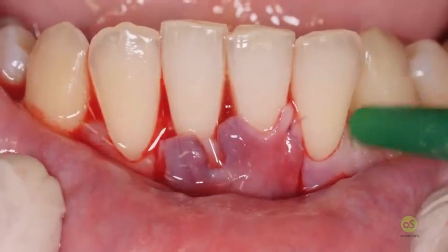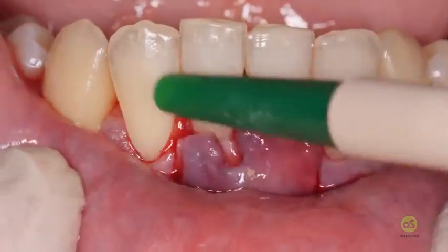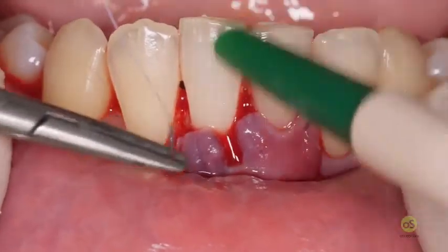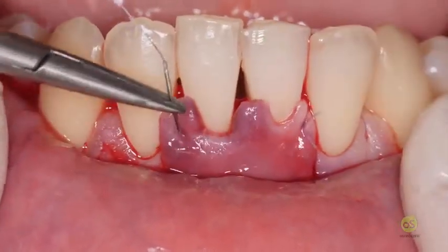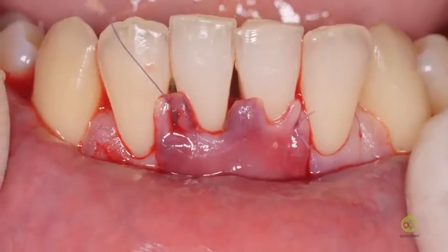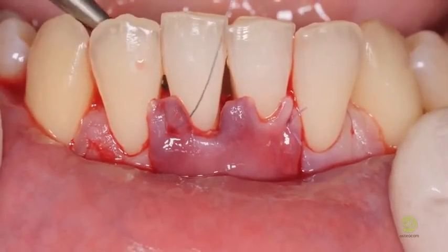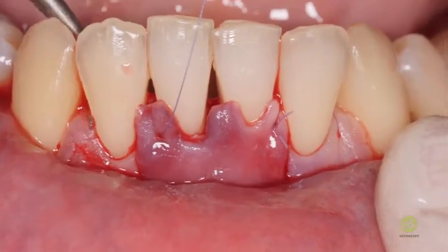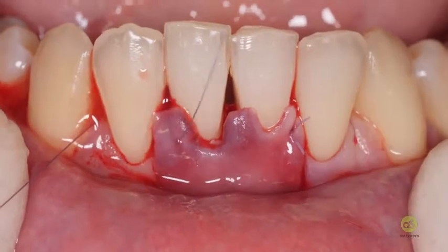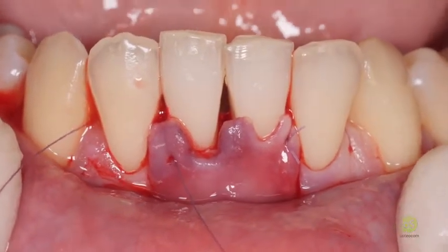Now I do the same thing on the distal papilla. Surgical, anatomical, lingual aspect. Take anchorage distal to the distal papilla that was not elevated, but this allows me to position the papilla in the final position.